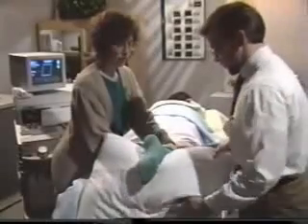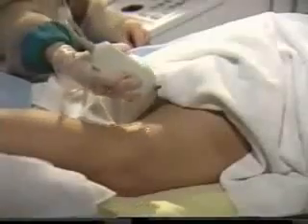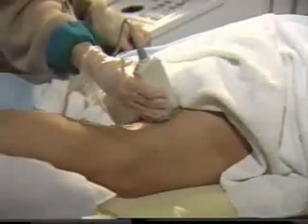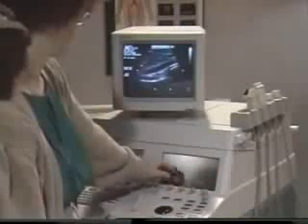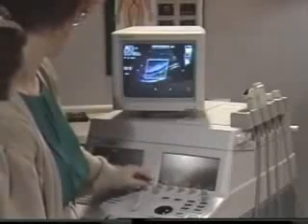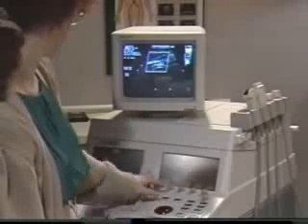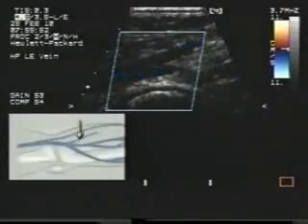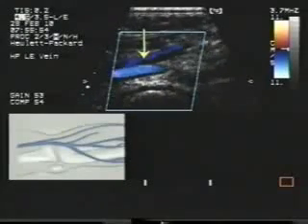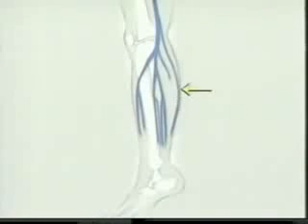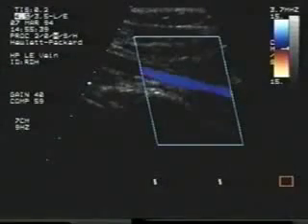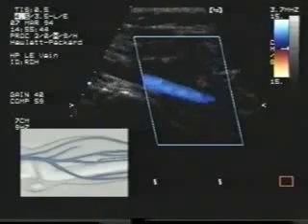To achieve a good view of venous blood in the calf, good patient positioning is essential. Here the patient's leg is flexed over a pillow, which helps keep pressure off the knee and keeps the veins from constricting. To begin, position the transducer posterior to the knee in a longitudinal orientation as far up as possible. This positioning should display a long straight segment of the popliteal. You may see the insertion of the lesser saphenous high in the popliteal. Watch for the gastrocnemius veins in the mid-popliteal area. The popliteal and calf veins travel close to the bone, so you'll need to focus deeper to see these deep vessels.